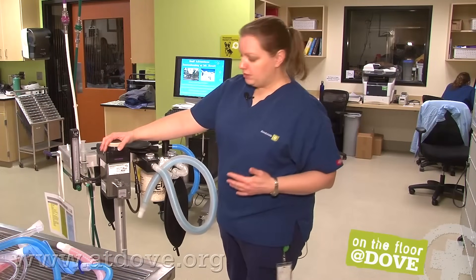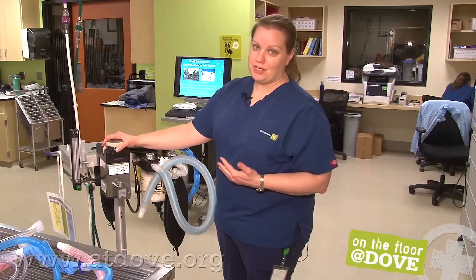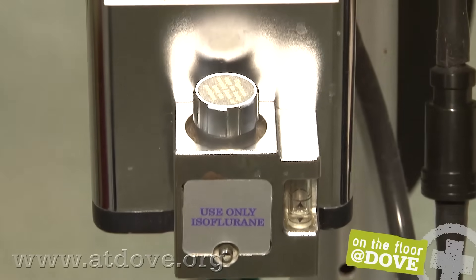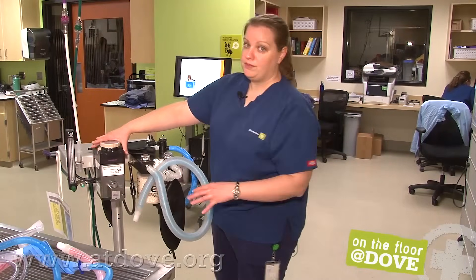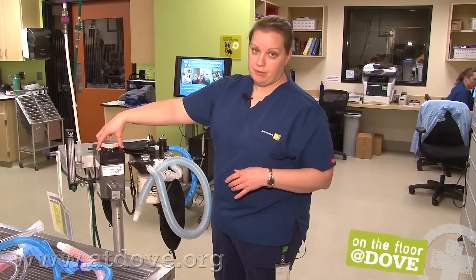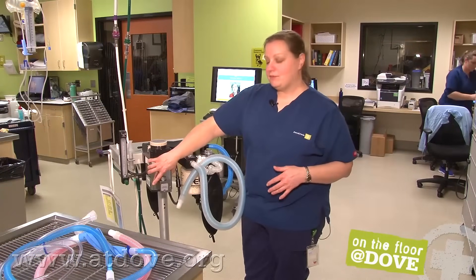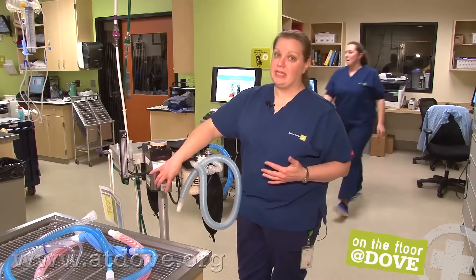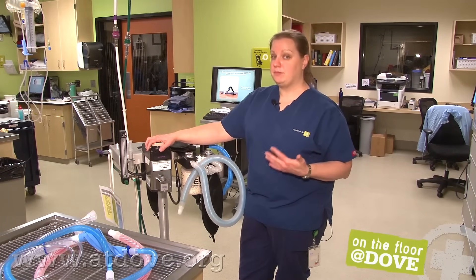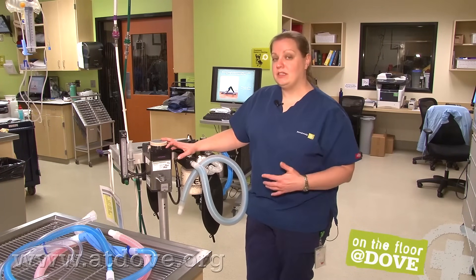This is the vaporizer part of the machine, where liquid anesthetic is turned into a gas for the patient to inhale. Here we use isoflurane; sevoflurane is another popular gas anesthetic. Before you perform a procedure, just check the level of your gas — it's important not to overfill and to make sure you have enough for the procedure. These are called precision vaporizers, so you can set them to a very specific rate. Be careful with your vaporizer: don't bang it on the edge of a table, and if the machine tips over, it will affect what your vaporizer is delivering. Have it inspected on a regular basis to make sure it's actually delivering what you think it is.